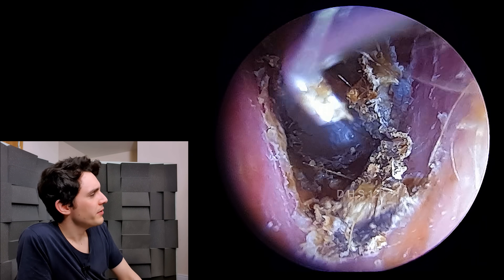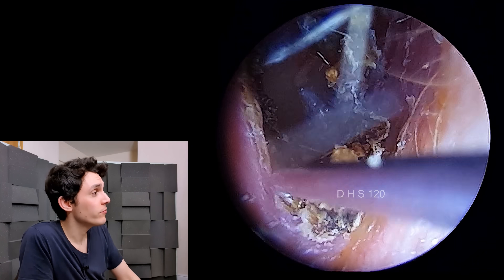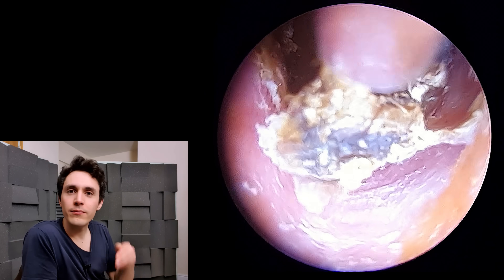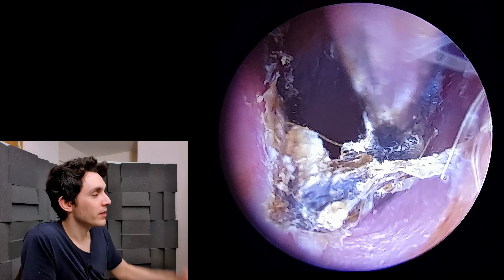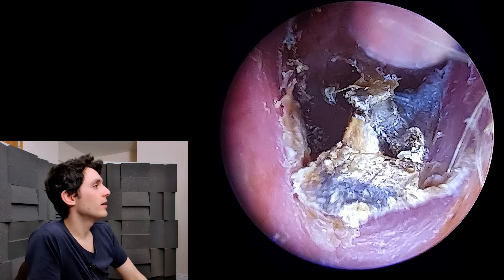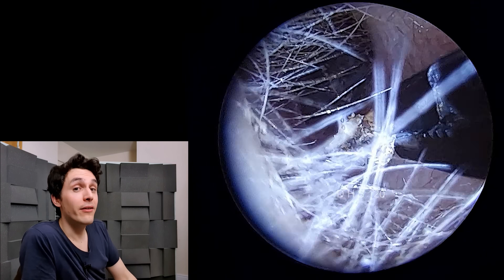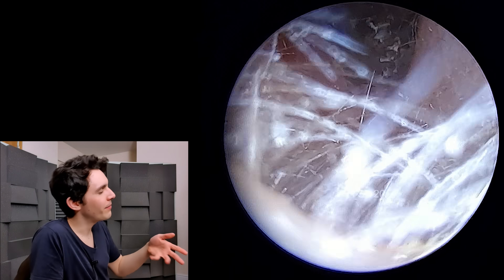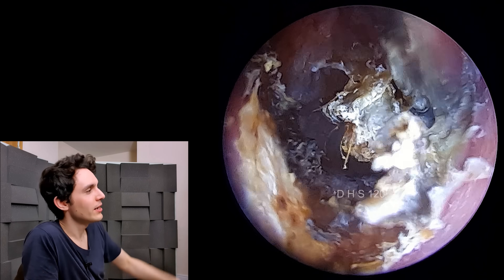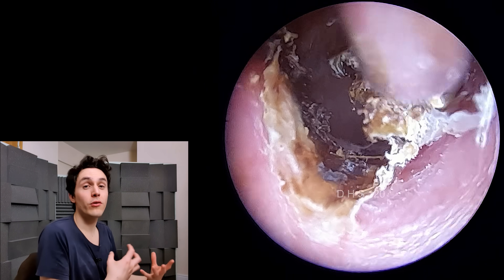I'm going in with a hook now. This may look like a Cawthorn hook to you, but you'll notice the end isn't sharp. This was a hook specially made for me by a company called Chef Med — big shout out to Chef Med. It's just nice to have a very small tool that isn't pointy on the end, so you can have a bit more leeway when going in to get the debris. The Cawthorn number six is still a hook I use very often, but this prototype from Chef Med is the hook of choice now. Moving on to crocodile forceps — this is a part of the video where I had to edit quite heavily.